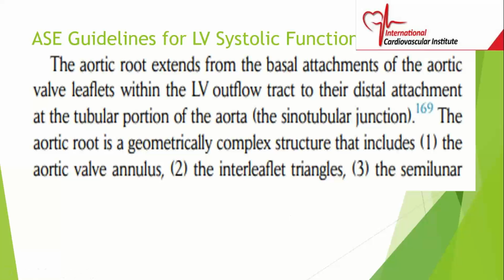So by definition, the aortic root extends from the basal attachment of the aortic valve leaflets within the LV outflow tract to their distal attachment at the tubular portion of the aorta. And I'll explain on the diagram what that is. But you're starting from the lowermost attachment, and you're going to go distal to the tubular portion of the aorta. So when we say evaluate the aortic root, we want you to evaluate all of that.